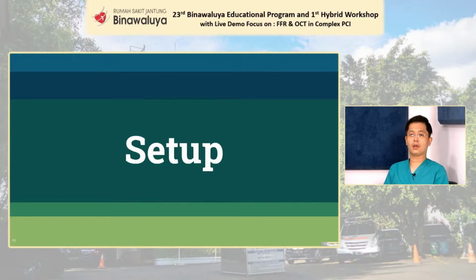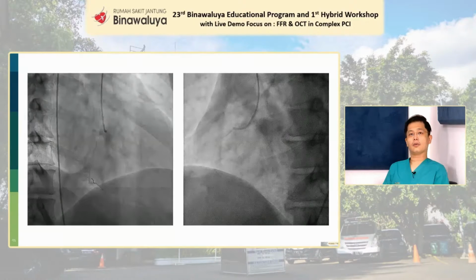But prior to the measurement of the FFR, my routine practice is to first measure the RFR to see what the RFR is, and then I would proceed into the FFR assessment, and all of these would actually be shown during the case presentation. So this is the first case.